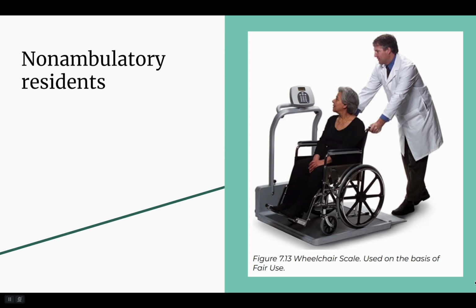If a resident requires transfer with a full-body mechanical lift, some lifts have a scale function that can weigh the resident as they transfer from bed to wheelchair.